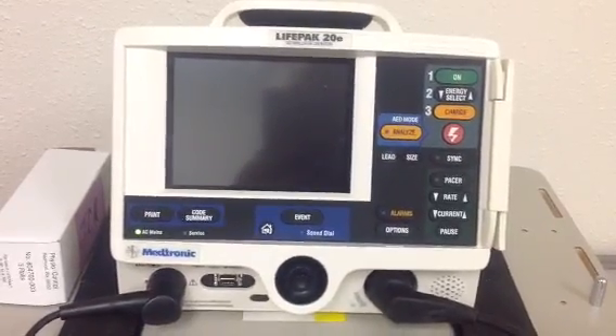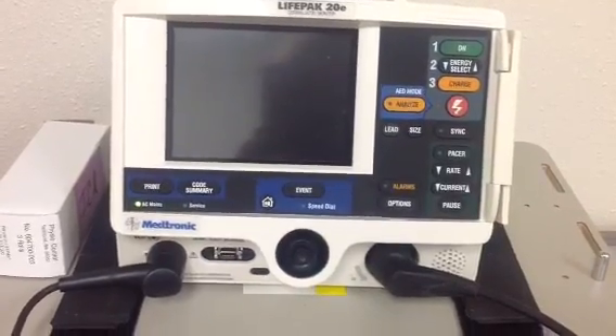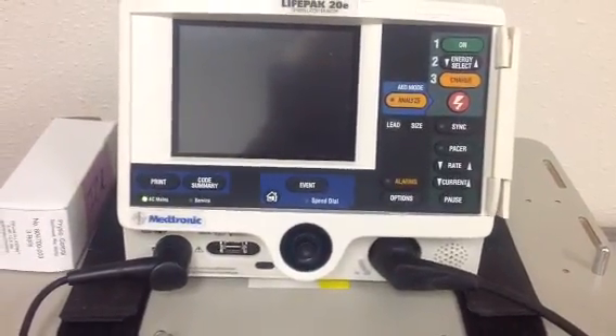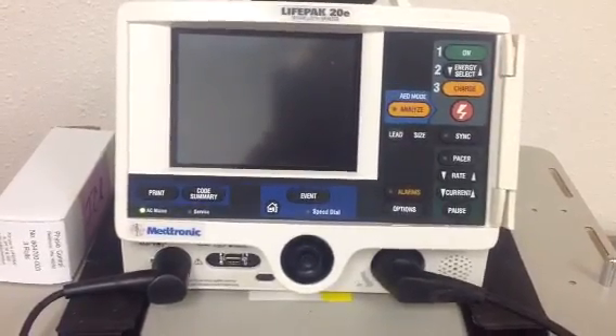Hi guys, this is our LifePak 20 that is in our laboratory and we are in the company of our Sim Man here, and we're going to show you how to operate the defibrillator.